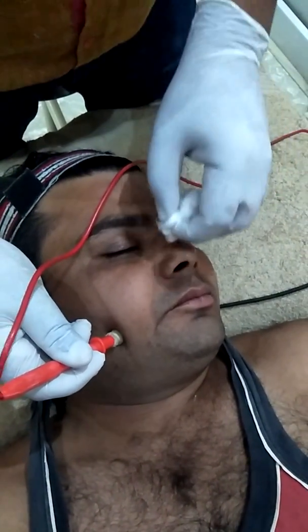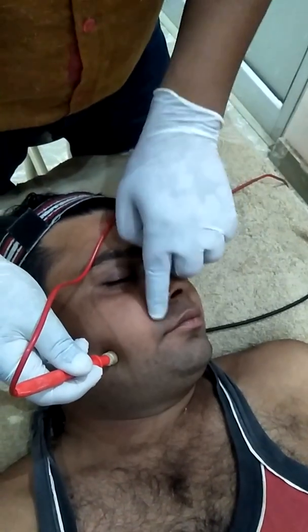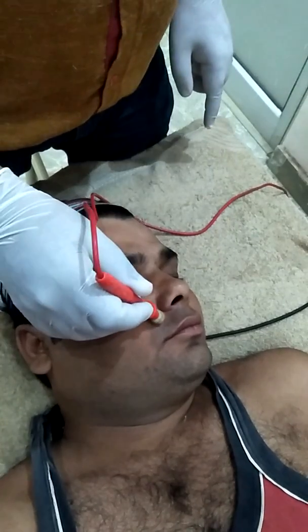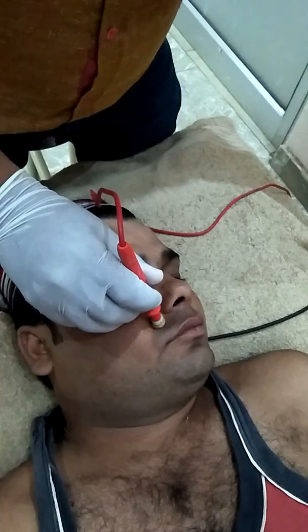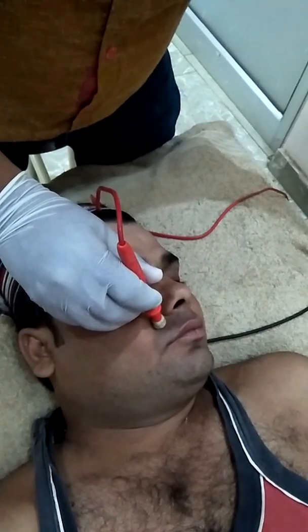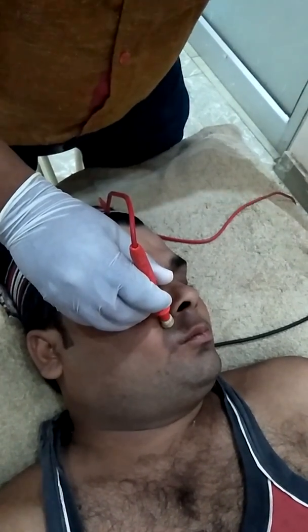Now going to the next level, we are going to the orbicularis oris. The motor point of this muscle is there. When you increase the intensity, it shows fluffy lips, like you can blow like this.